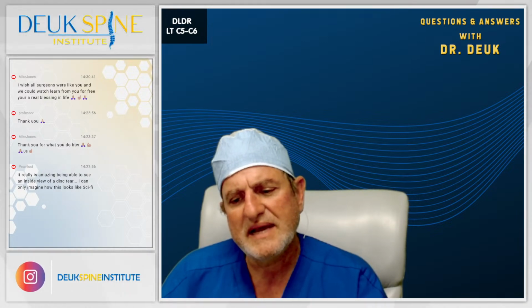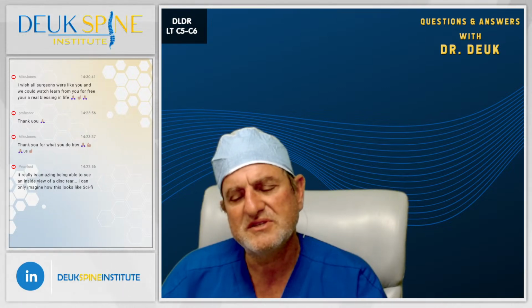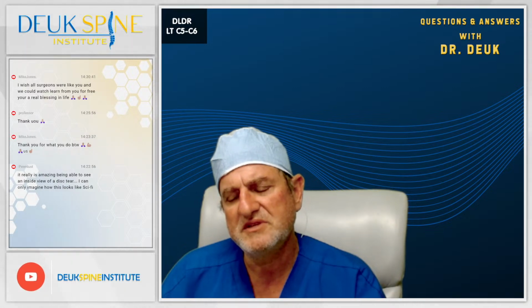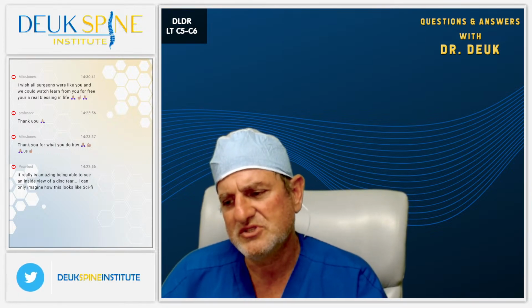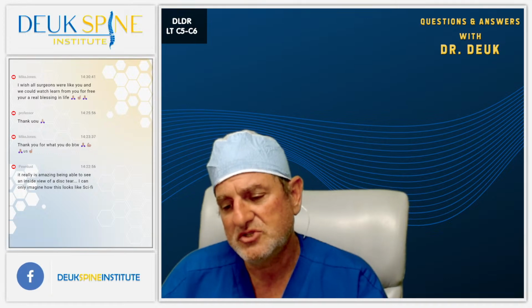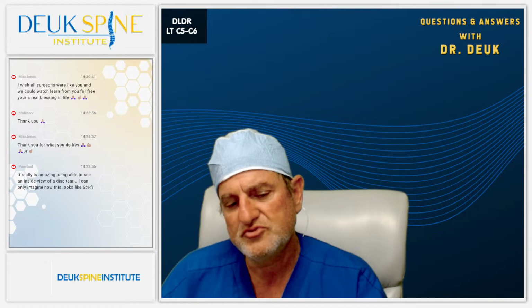And then the last thing I do is put some vancomycin powder in the disc as I'm finishing. That's because in America, most of our spine infection, discitis, and osteomyelitis is going to be gram-positive. So vancomycin is typically very effective. Without knowing the culture sensitivity, vancomycin is a good choice. You may want to choose something else depending on your population. But placing intradiscal antibiotics is a great idea. So anyway, kudos to you.